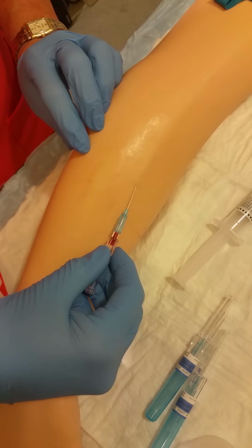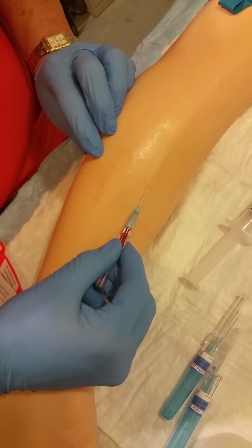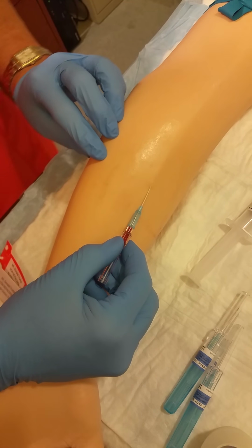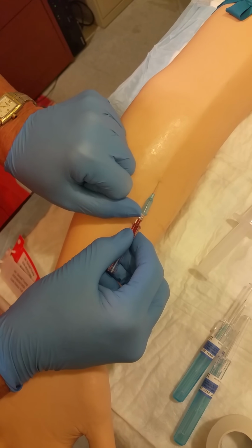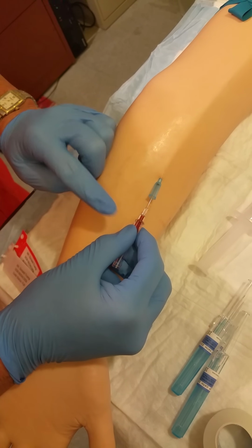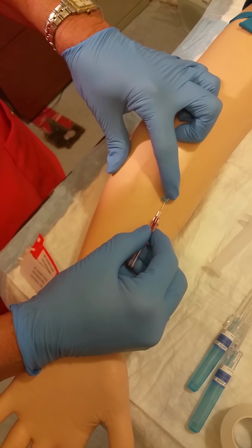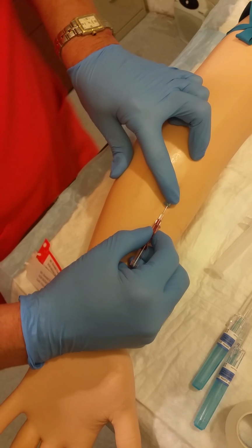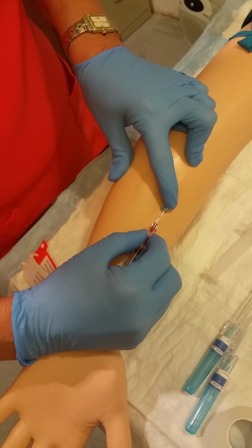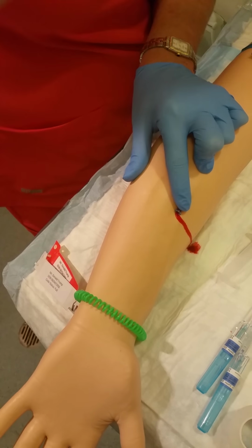When I know I'm in the vein, I advance the needle and the catheter together a millimeter or so, and then I just advance the catheter while stabilizing the needle. I hold the hub with the index finger of my left hand. I occlude the vein with the middle finger of my left hand, and I go directly into the sharps with the needle.